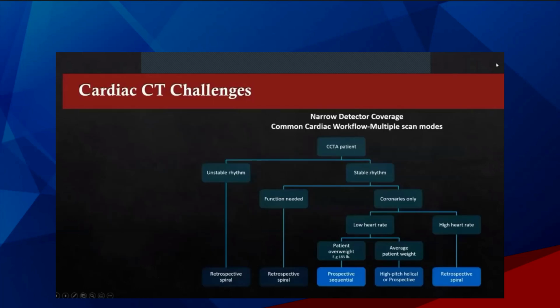Now that we have covered some of the specific parameters that are particularly important when acquiring CT cardiac imaging, let's take a look at things from a slightly broader perspective. You have your top-of-the-line CT scanner, and now you have to decide how you will scan these patients' cardiac or coronary examination. This is just an example, but you can appreciate the complexity of this algorithm.